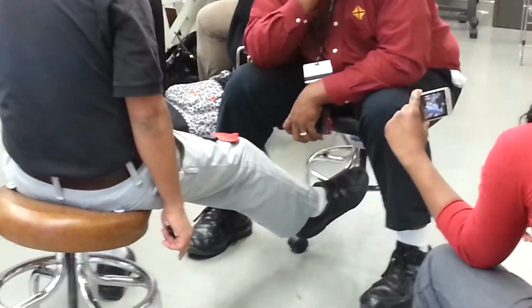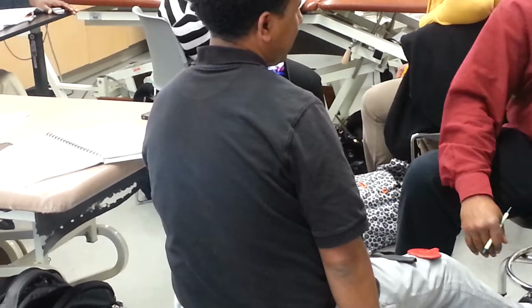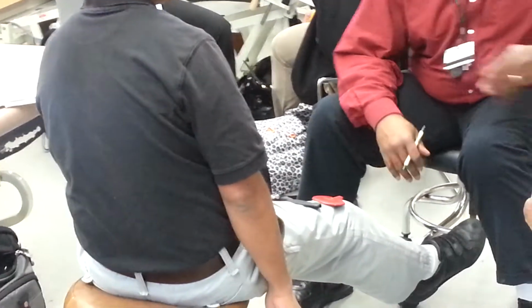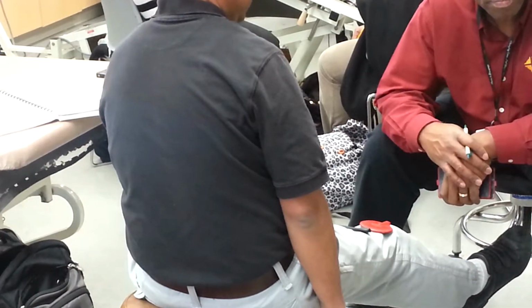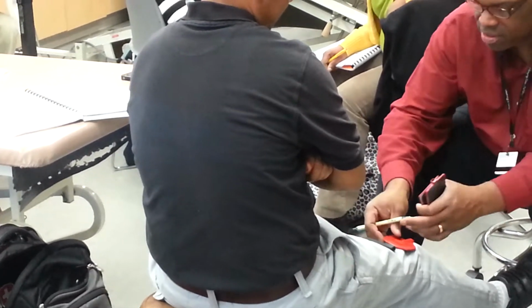All right, what is going to happen? Shock. It's not going to be enough. Superficial pain. Too close. It's based on superficial burning. You would have to check with Miss Sonia on that one. So it's too close because the space has to be, how do I say it? You need one. Okay, say it in your language. There should be a space. Yes, so I need at least one electrode space in between.